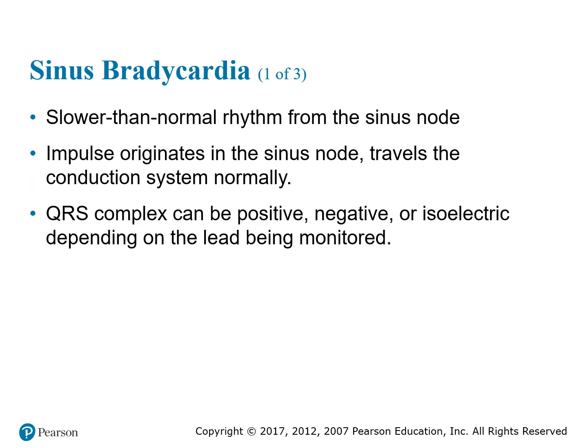So, what do we call a slow heart rate? If the rate is below 60, remember it said the normal rate is 60 to 100. If the rate is below 60, because we have the P waves, that is what they call a sinus bradycardic, B-R-A-D-Y. Anytime you see the word Brady, that means slow. You see that several times in different medical terminologies and referring to different things. But if you see the word Brady, it's slow.